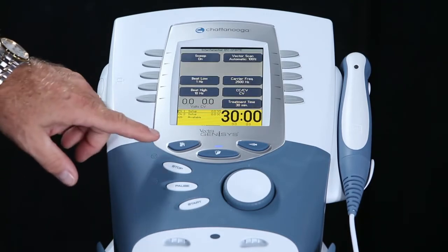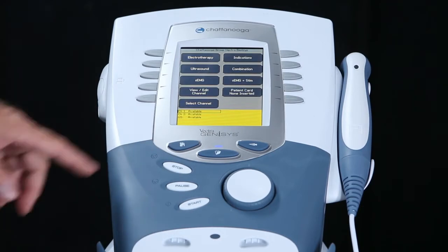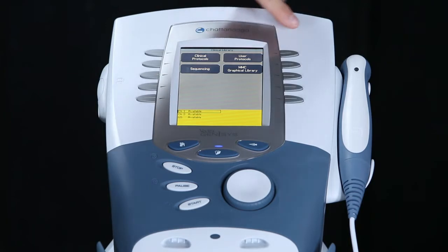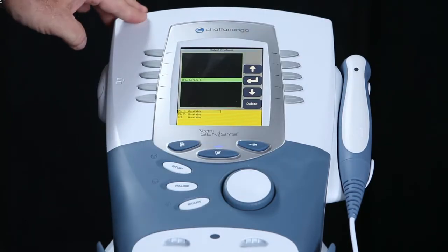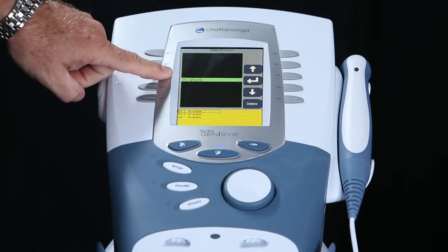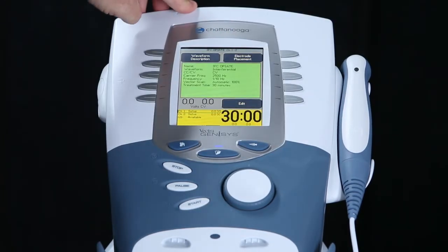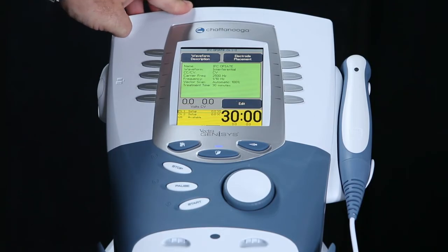In order to retrieve the protocol, from the home page, we will press the folder key. We will then press the user protocols key. We will highlight the protocol IFC opiate, press enter, the protocol will appear, and we can now begin the treatment.